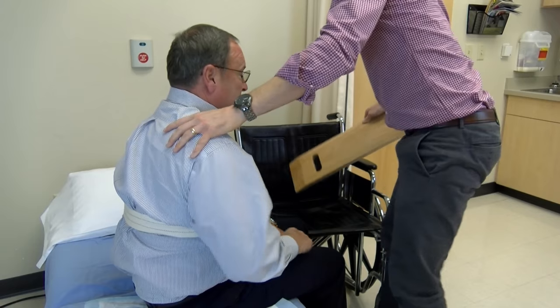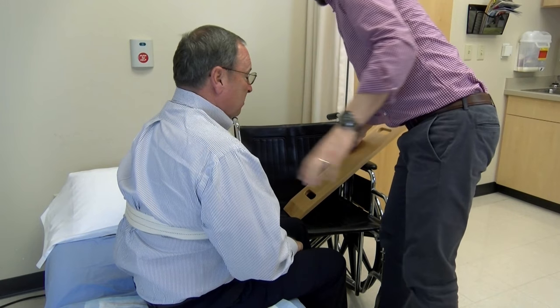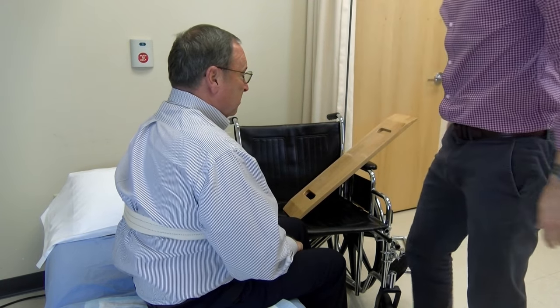Have the patient lean again to remove the board from underneath their bottom. Make sure the patient is safely on the table and remove the gait belt.